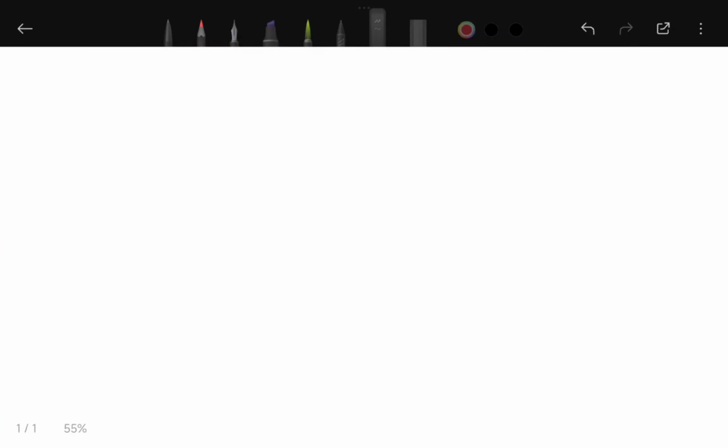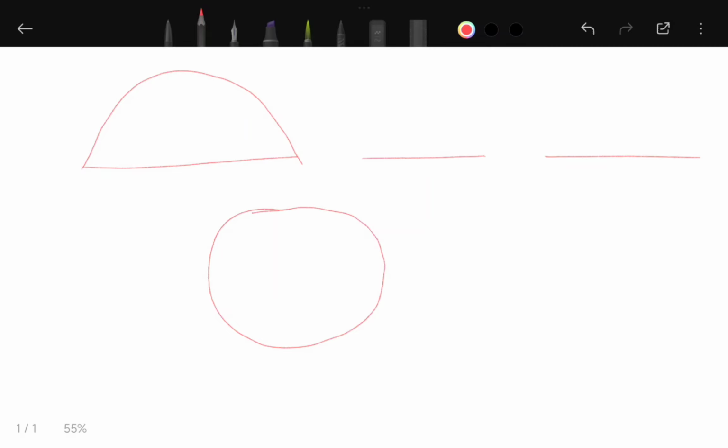What will happen to the lens? Now suppose we'll take three lenses of different sag. One lens sag is very high. So before that you should understand what the difference is between sag and the base curve. Base curve we always take from the center. So this is the base curve.